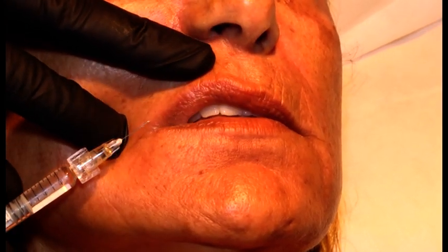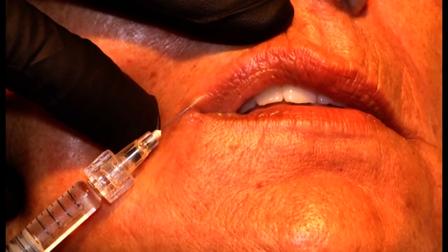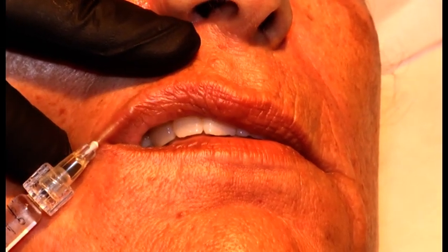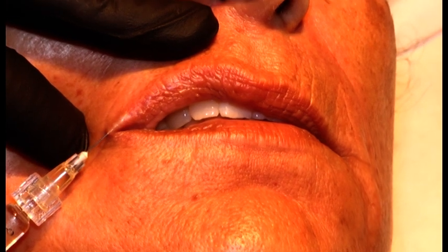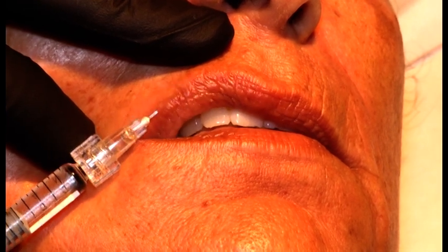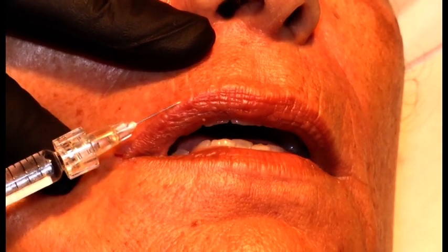All right, so I start at the vermilion border. 1, 2, 3. And I introduce the needle into the vermilion border. I advance it. I start to inject a retrograde linear thread. 1. This is just standard lip augmentation with needle. 2.